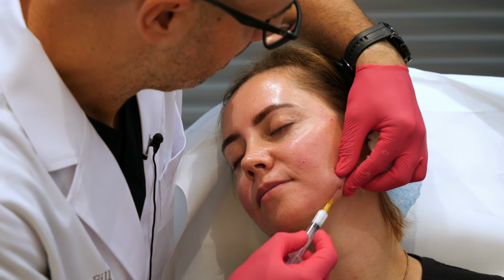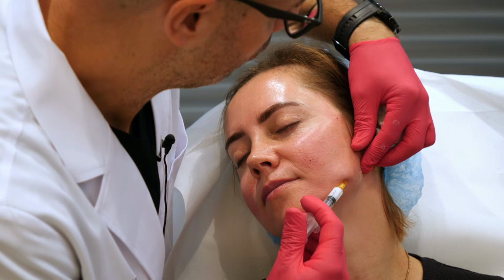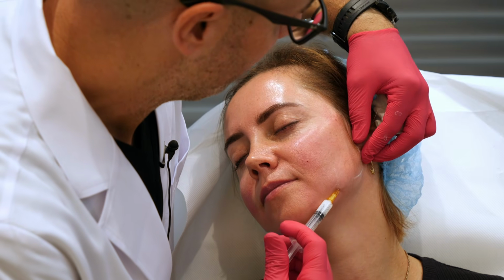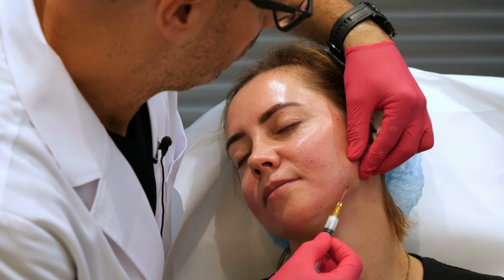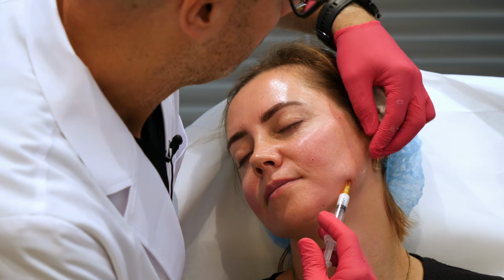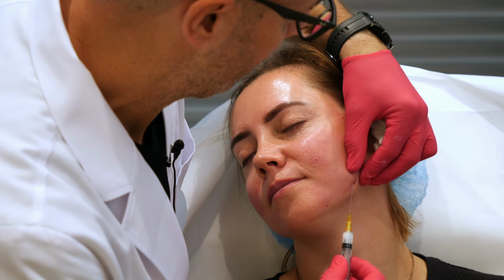And just now, I'm going to the musculocutaneous fibers to promote the lifting effect in this area.